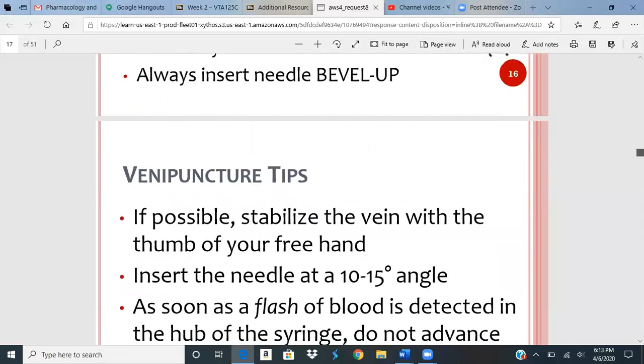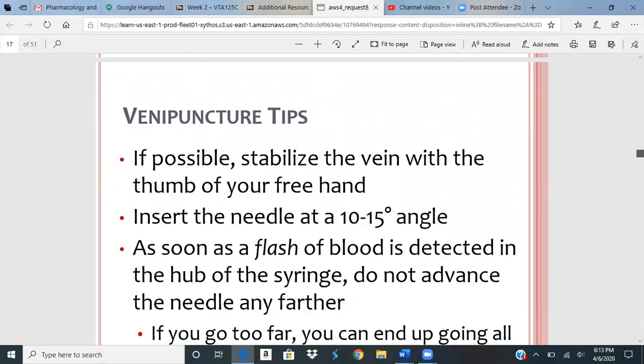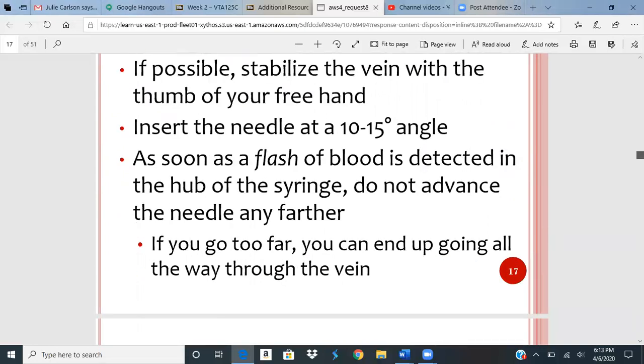And then more tips for you, especially with the saphenous vein. If you put your thumb next to that vein, it's going to stabilize a little bit more. Like I was telling you, you go to put your needle into that saphenous vein and it's super wiggly. It likes to roll around. You put your thumb next to it, it kind of stabilizes a little bit more. So when you go to put the needle in, it's going to bump up against your thumb versus just wiggling around. A 10 to 15 degree angle, usually, we're going in.